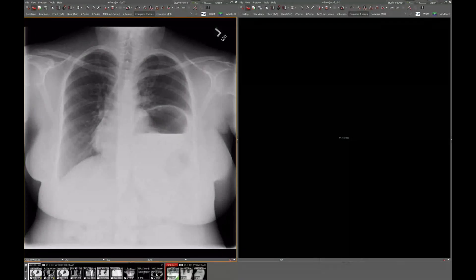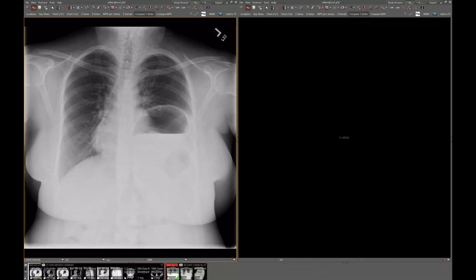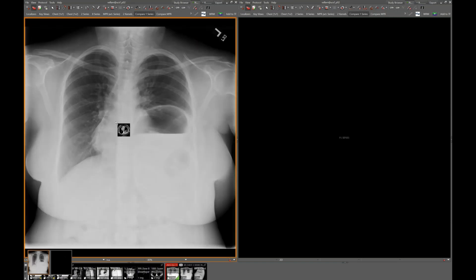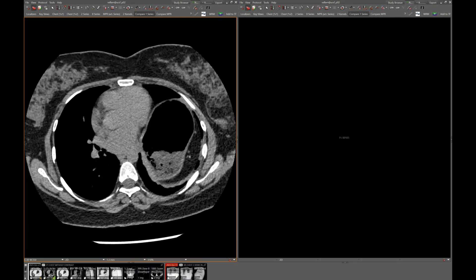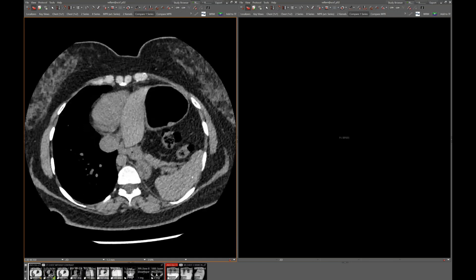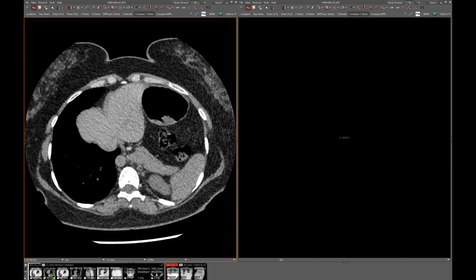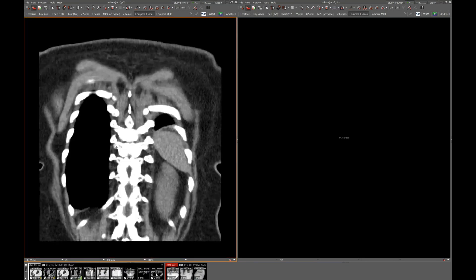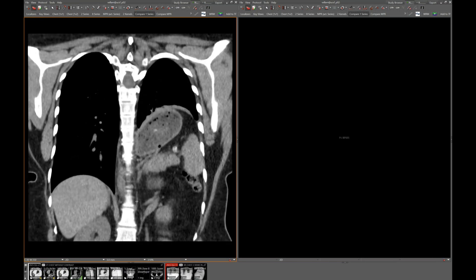A good companion to the previous trauma case: this outpatient was sent for chest radiograph because of diminished breath sounds at the left base. The radiograph shows what looks like elevation of the hemidiaphragm with a very large stomach bubble underneath. CT confirms the hemidiaphragm is elevated with the stomach pushing up, but looking closely at the diaphragm it is very thin compared to the other side — suggestive of chronic paralysis of that hemidiaphragm.